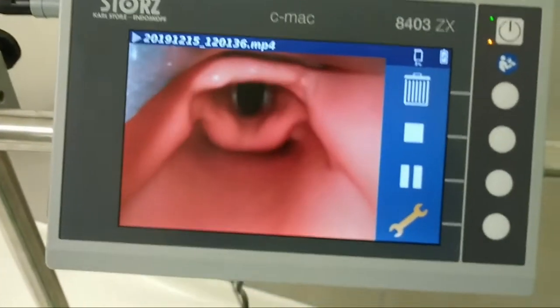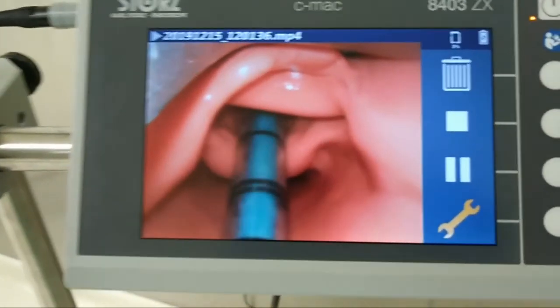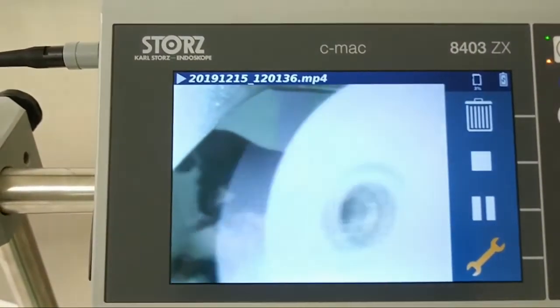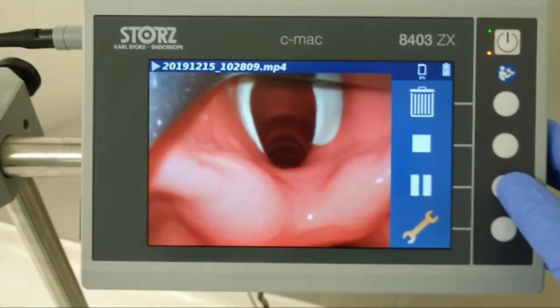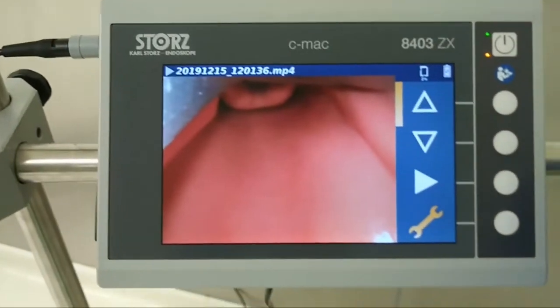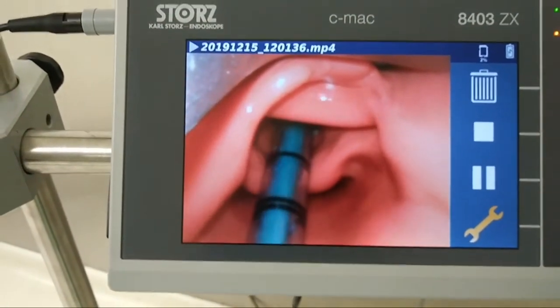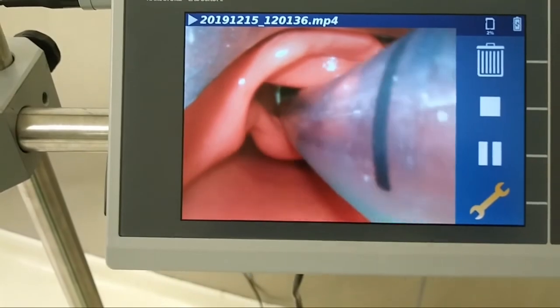This is a demo view on a mannequin. If you are using a stylet, it is much easier. Otherwise, we can't get through in the correct direction. This is one of our previous demo classes. We can pause, stop and play. One demerit is that we have no space to keep the blade, the charger and the connecting cable.